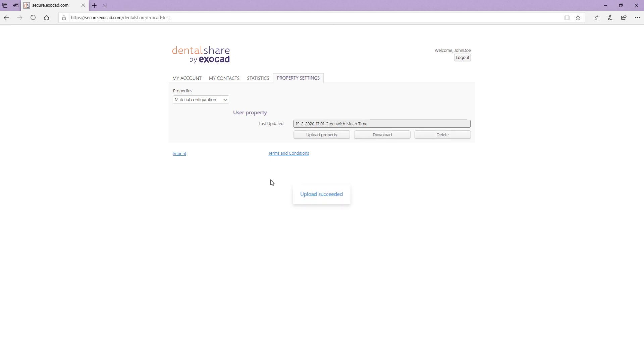To download a material list, select it in the Properties drop down and click Download. You can also delete it. Note, it is up to your reseller's discretion to give you access to the Property Settings tab.